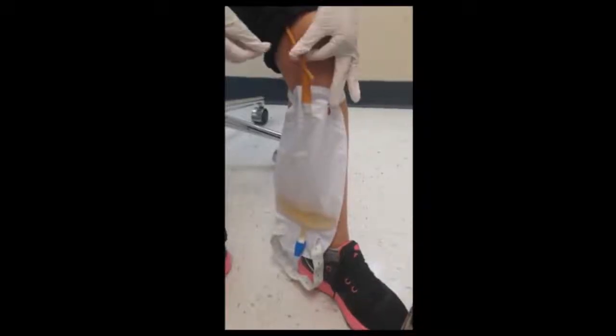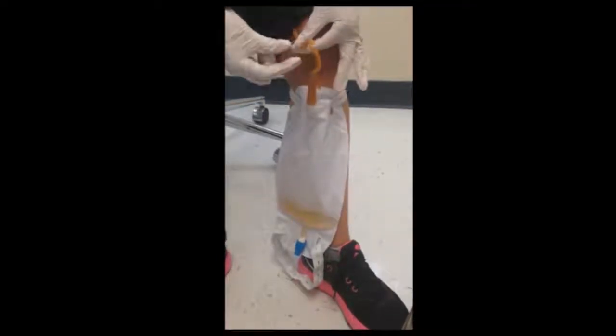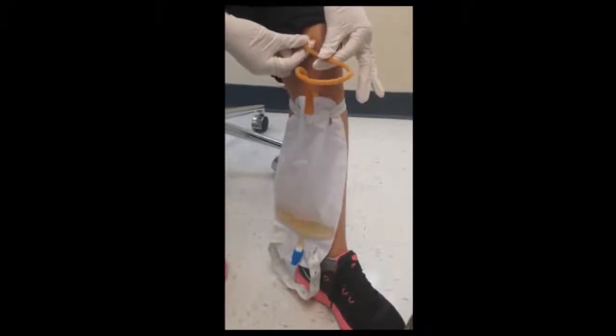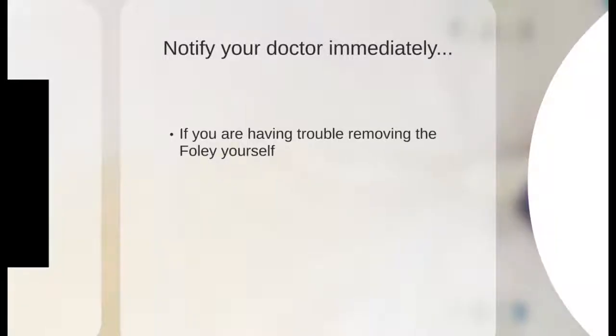Once all the fluid is drained, slowly and steadily take out the catheter. If you are feeling discomfort, softly and repeatedly cough while counting in your head the number of coughs. If you are having trouble removing the Foley catheter yourself, please consult your doctor immediately.